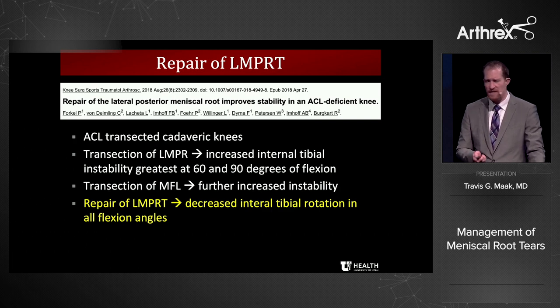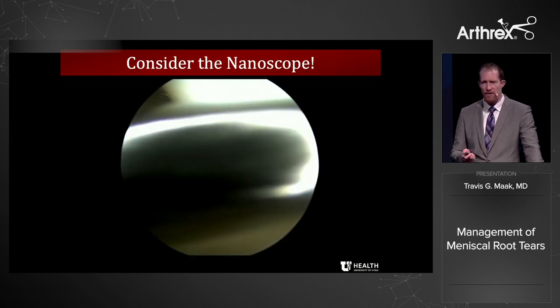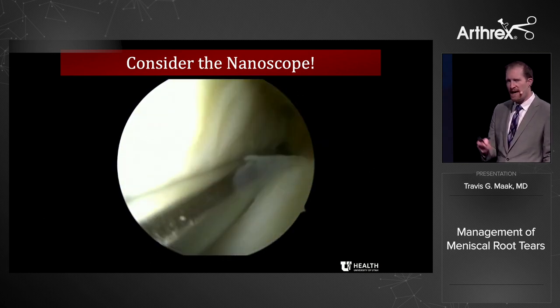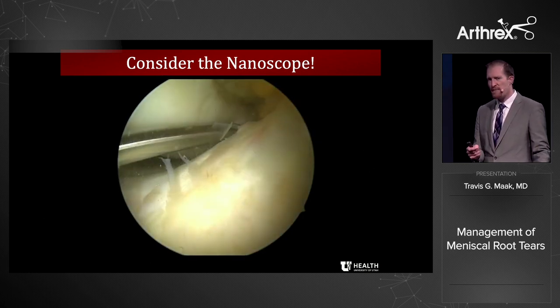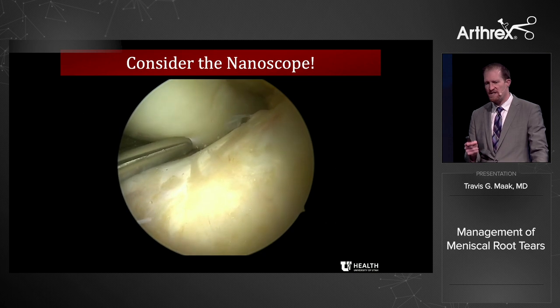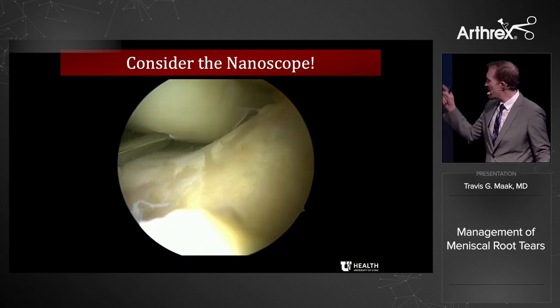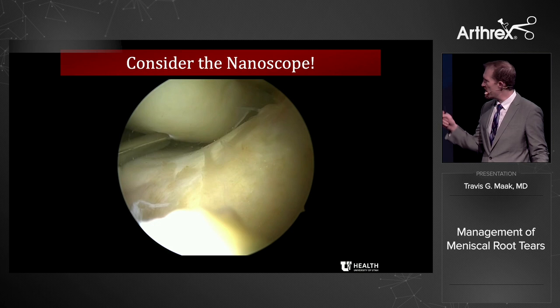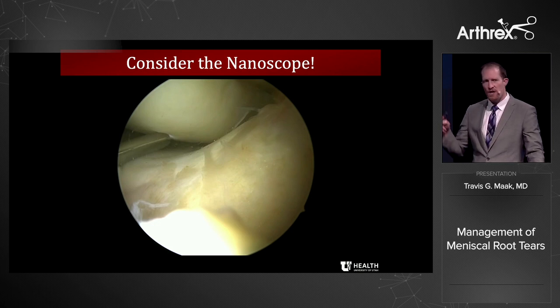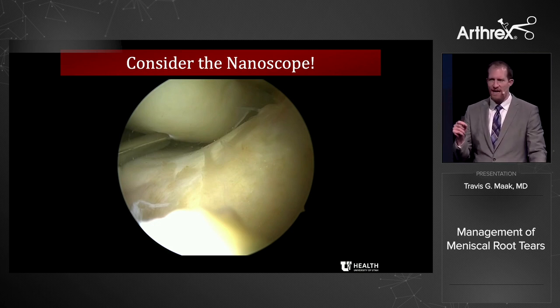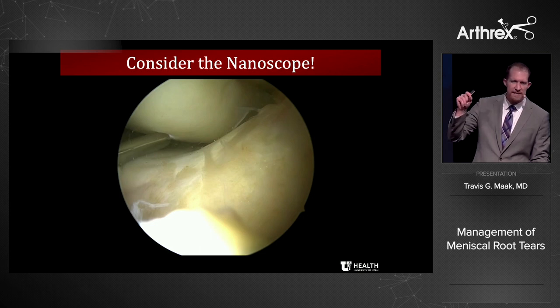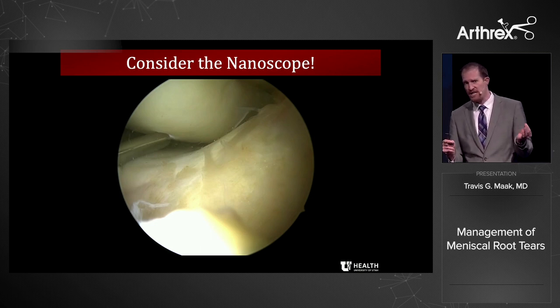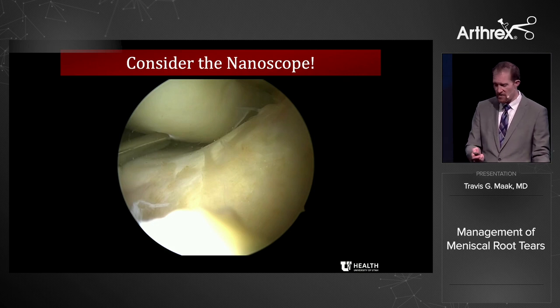I would suggest the nanoscope is a very good opportunity for evaluating and treating these tears. The medial meniscus root can be very hard to visualize in tight knees. Here you can see the nanoscope visualizing the medial side. It also bends, which reduces cartilage damage and scope trauma when trying to view the medial root. You can either percutaneously release the MCL or use the nanoscope.